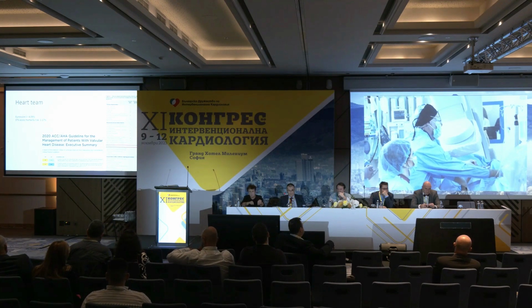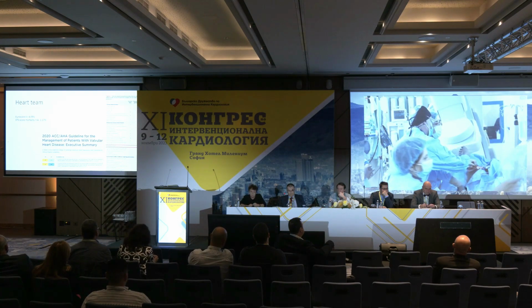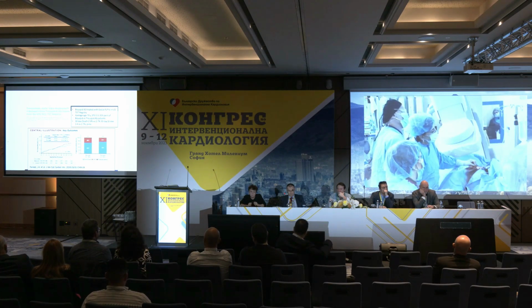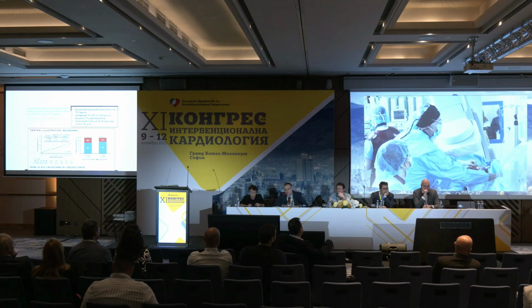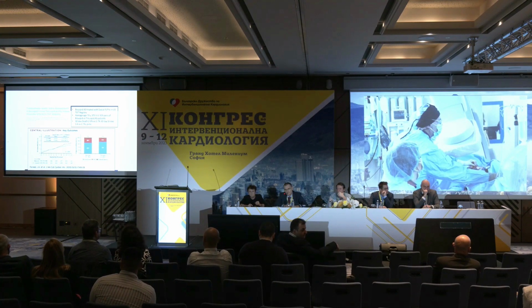Indeed, the bicuspid aortic valve is more favorable for surgical aortic valve replacement, but according to the TVT registry, for bicuspid aortic stenosis treated with Evolut R Pro in the US TVT registry, we have patients with an average age of 73, 30-day death is 2.6 versus 1.7 if you compare it to patients with tricuspid aortic stenosis, and 30-day stroke rate is 3.4 versus 2.7, which is non-significant.